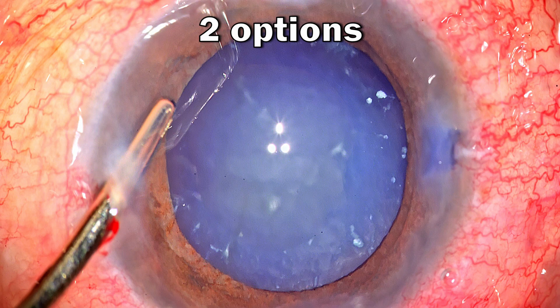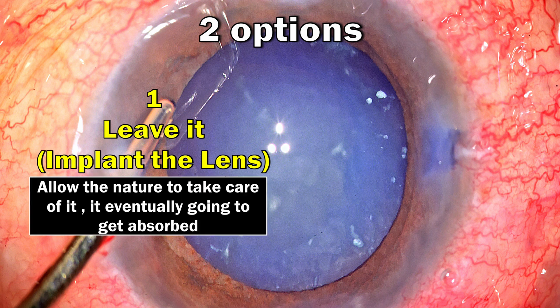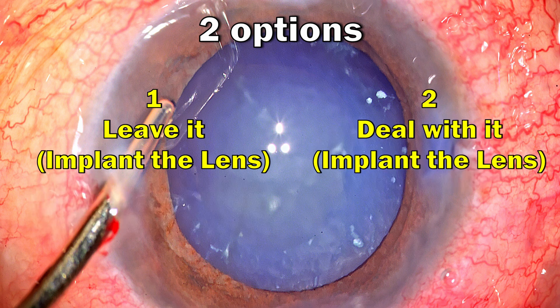In this situation I have two options. One: leave it as is, implant the lens, and allow nature to take care of it — it will eventually get absorbed, but it's going to take at least four to six weeks or a few months before that happens. There is also a risk of possible low-grade inflammation for a certain duration of time. So my preferred approach is different — I would like to deal with the situation in this setting itself.